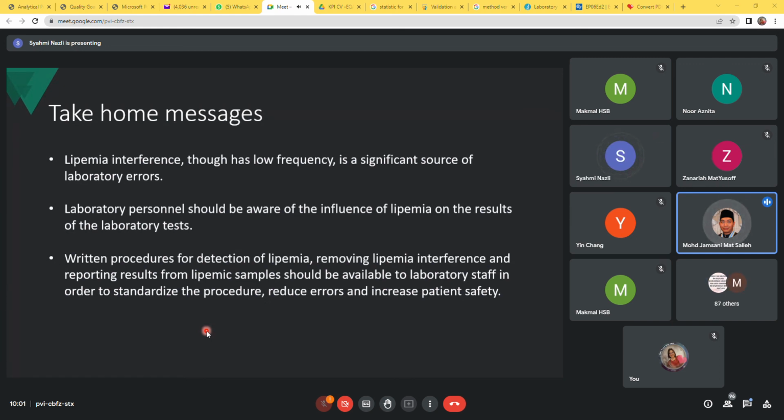So Puan Zanara tanya kalau dari KK kami perlu inform dulu ke nak hantar sampel lipemic atau hantar direct ke HPP. So untuk di KK Seberang Jaya, Puan boleh hantar ke Hospital Seberang Jaya sebab Hospital Seberang Jaya pun dah ada high speed centrifugation. Maksudnya just inform jugalah supaya kita get ready dan kita maklum bahawa yang sampel ini tujuan dia untuk apa, untuk high speed centrifugation supaya kita tak miss ataupun tak buat yang appropriate tindakan, dan seboleh-bolehnya kita nak laksanakan segera untuk lipemic sample.